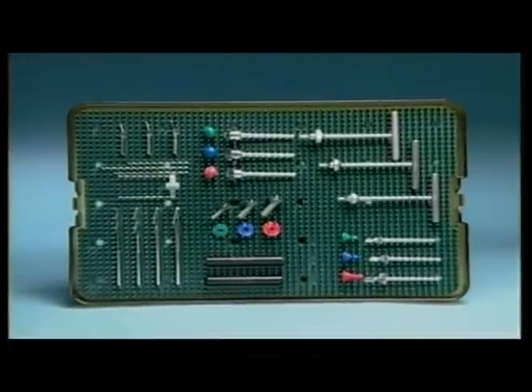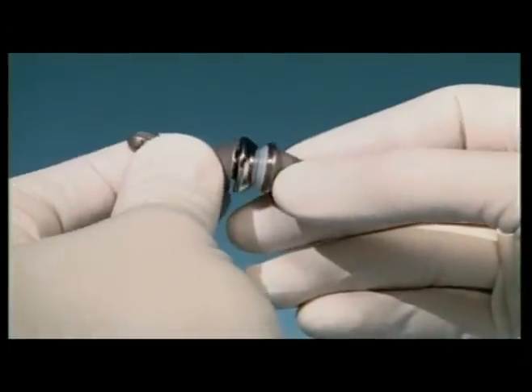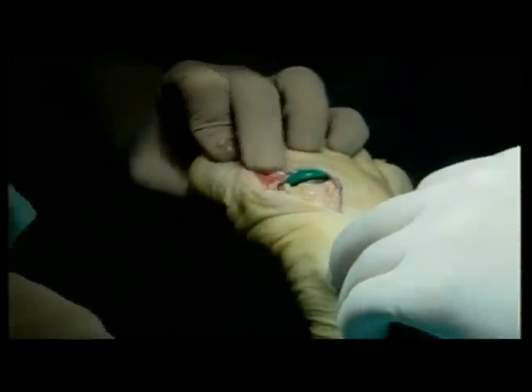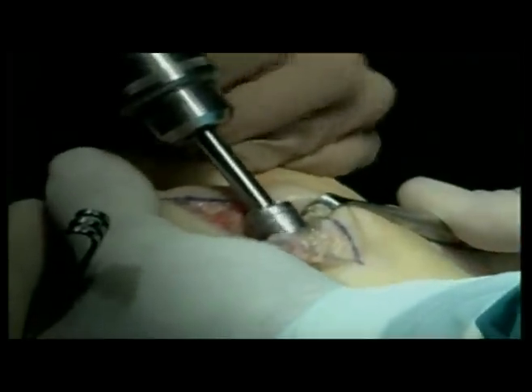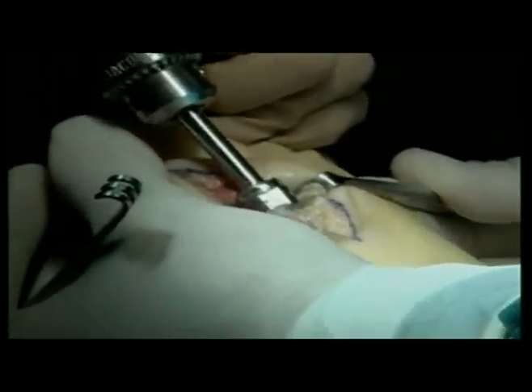Osteomed has designed the Reflection First MPJ implant system to achieve three goals: pain relief, superior function, and longevity. To achieve pain relief and superior function, we create implant stability with a cone-in-cone implant design. This provides inherent geometric stability and secures bone-to-implant seating. With simplified instrumentation, the implant is placed using a reaming technique intended to increase implant-to-cortical wall interface. The Reflection implant system is simple, predictable, and effective.